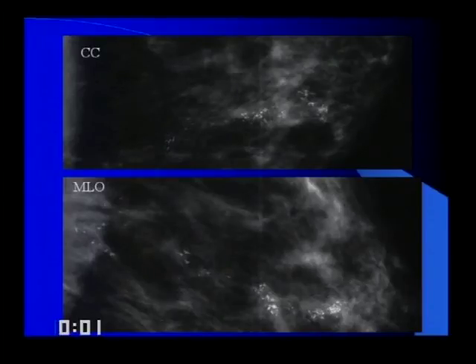So they're pleomorphic, but some of them appear rod-like, which could be secretory calcifications, but I think their pleomorphic nature makes them concerning for DCIS. Okay, so what are we going to do next? Stereotactic biopsy. Okay, and where are we going to do the biopsy? Which calcifications would you target? Take your pick. The second most anterior ones.